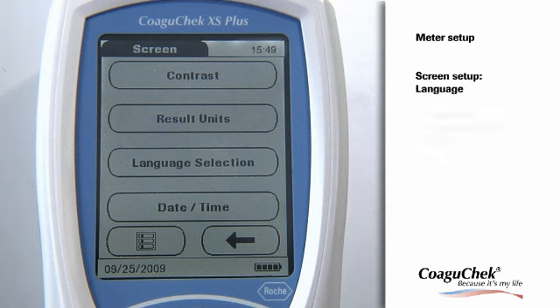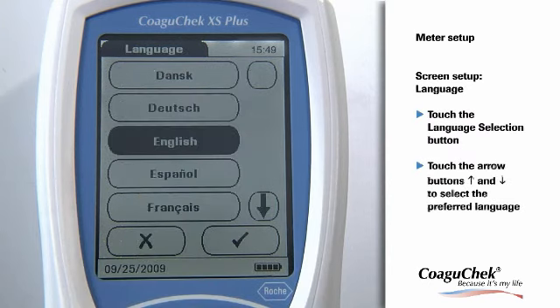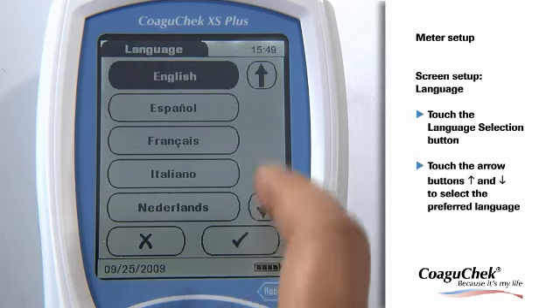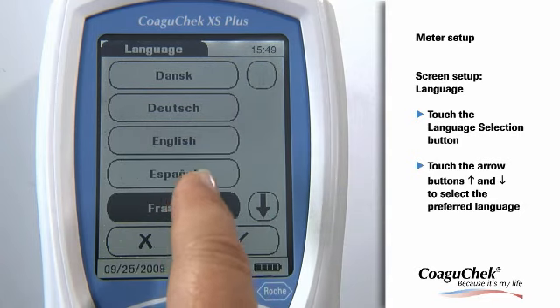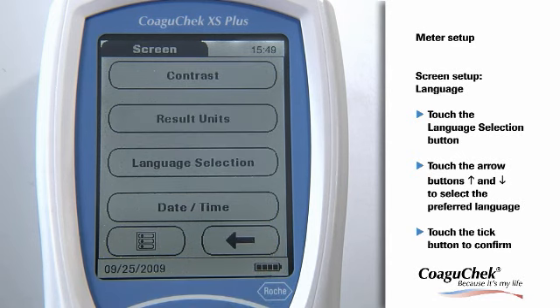Now you can select the language. Touch the Language button and scroll through the different languages with the arrow buttons. Make your choice with one touch on the preferred language. After you have made your selection, touch the Tick button to confirm. The program automatically returns to the Screen menu.